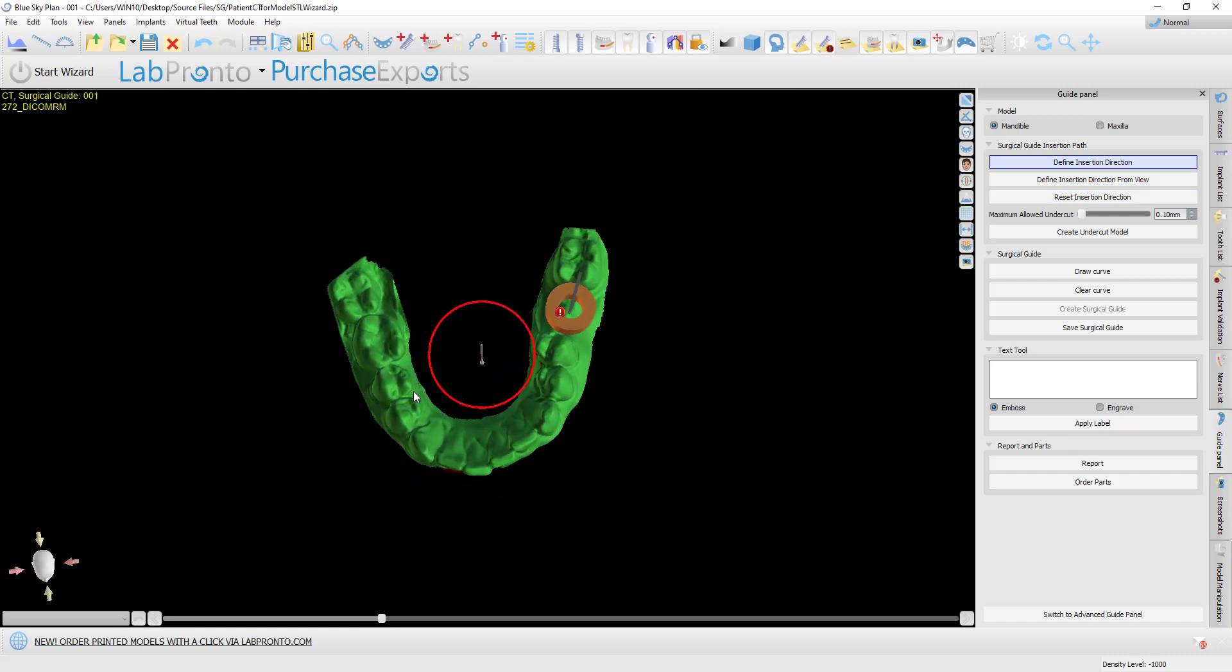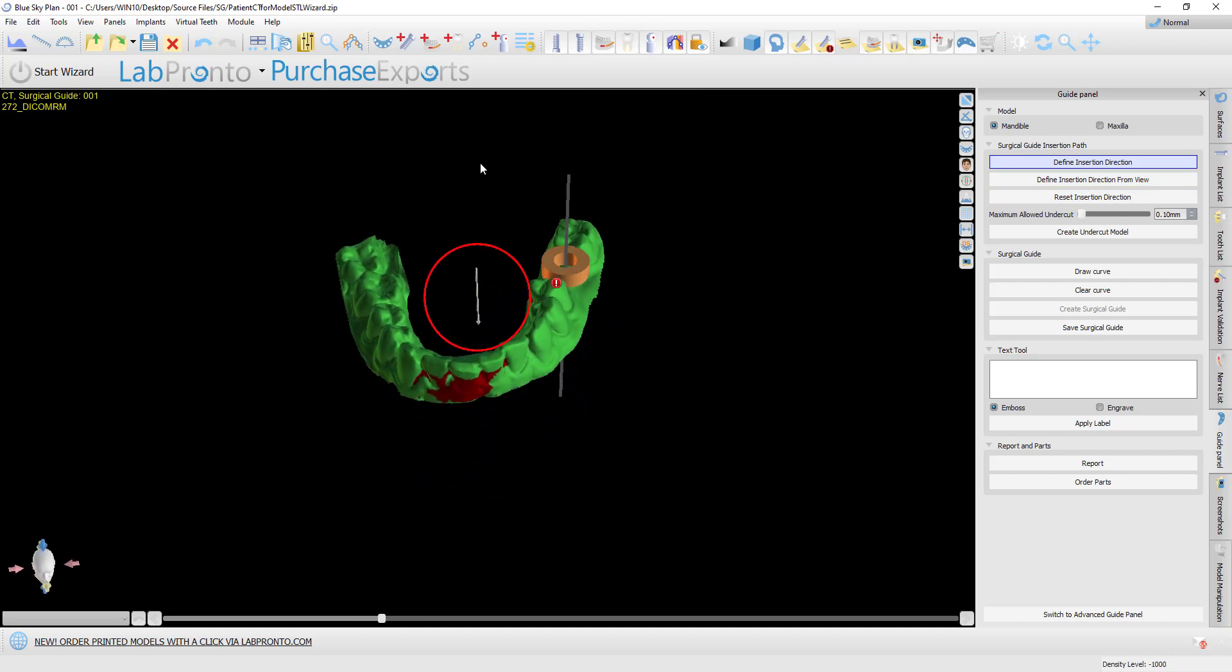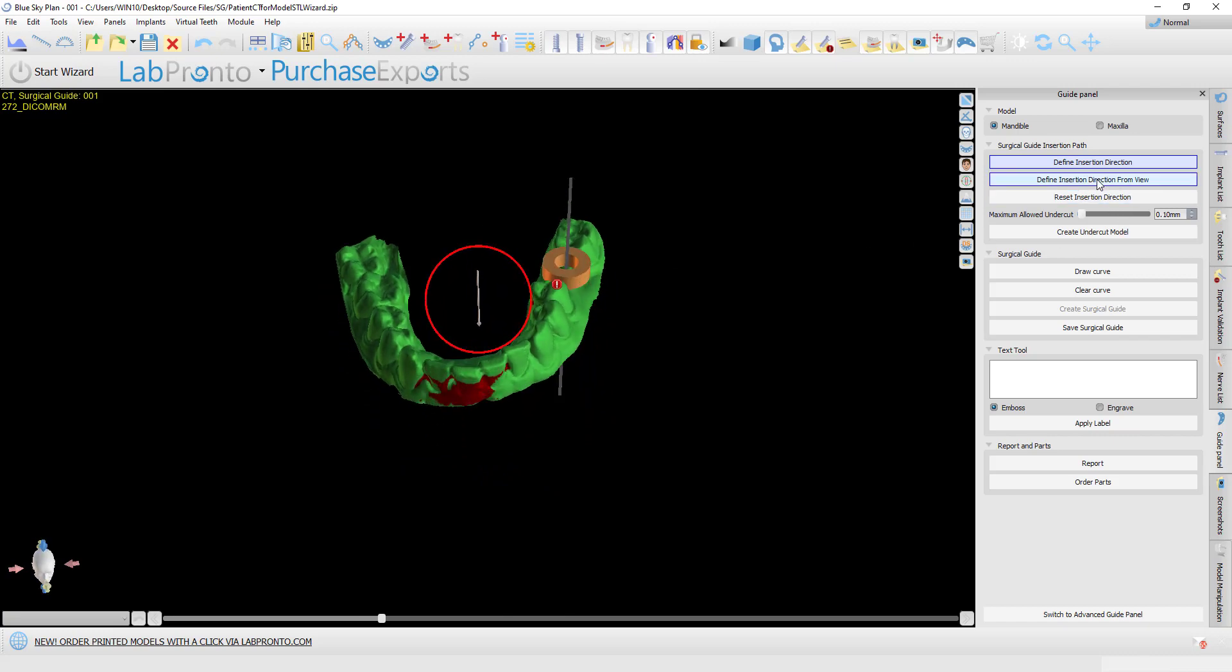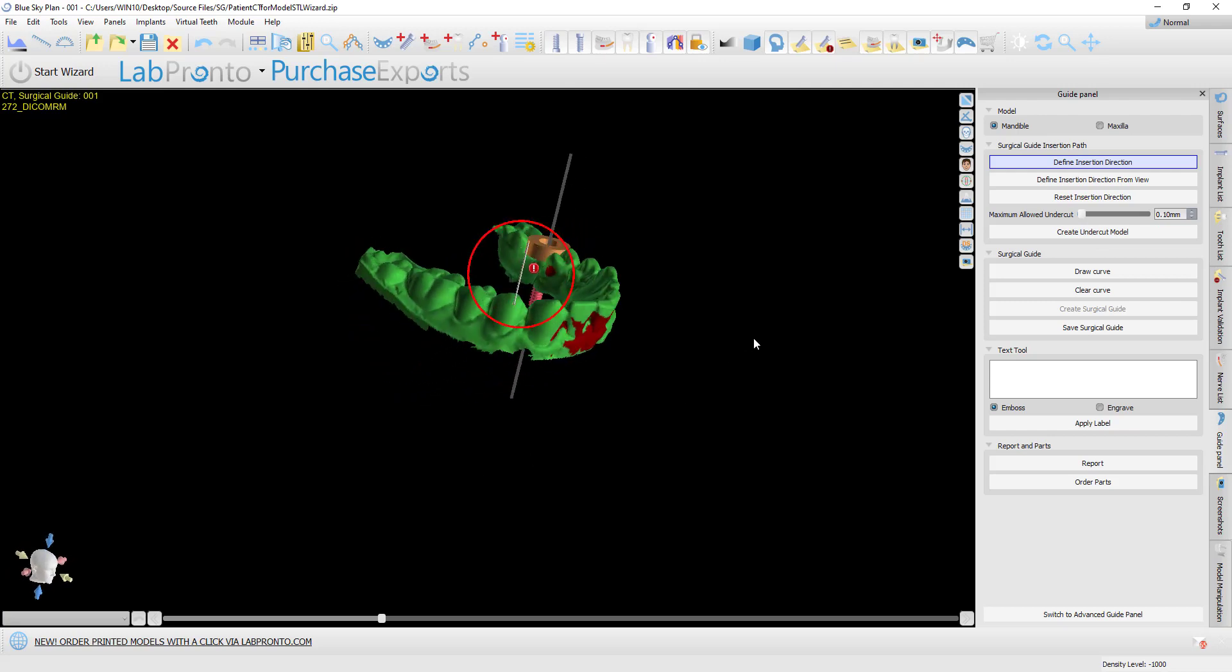Then we click 'create undercut model.' It's necessary to click that button to create the model with the undercuts removed and then create the surgical guide on that model.